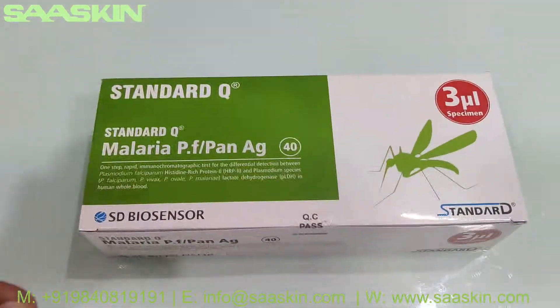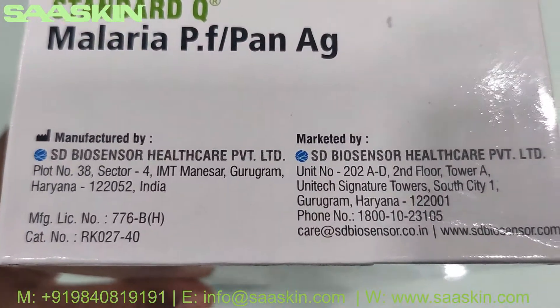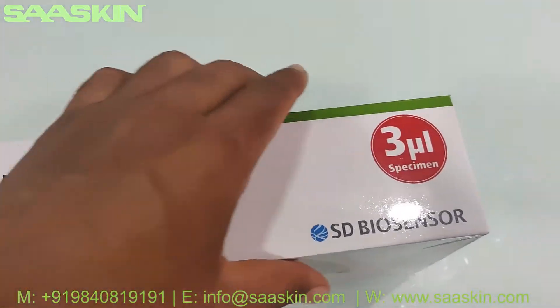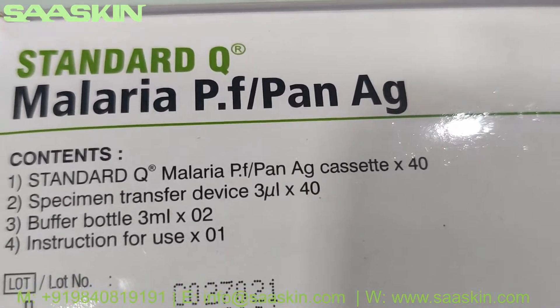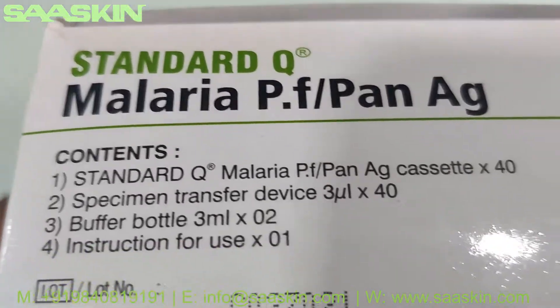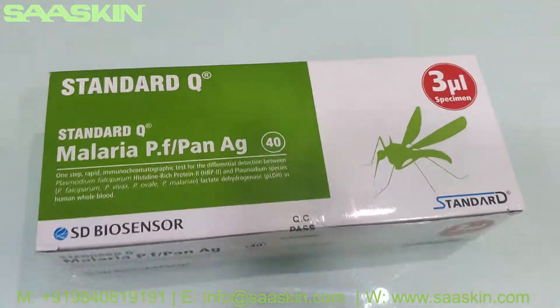Let me show you around the box. It is manufactured by SD Biosensor from India. The key contents here: it contains 40 cassettes, 40 specimen transfer devices, two buffer bottles, and the instruction for use. It has a 2-year validity period. This is how the box looks like.